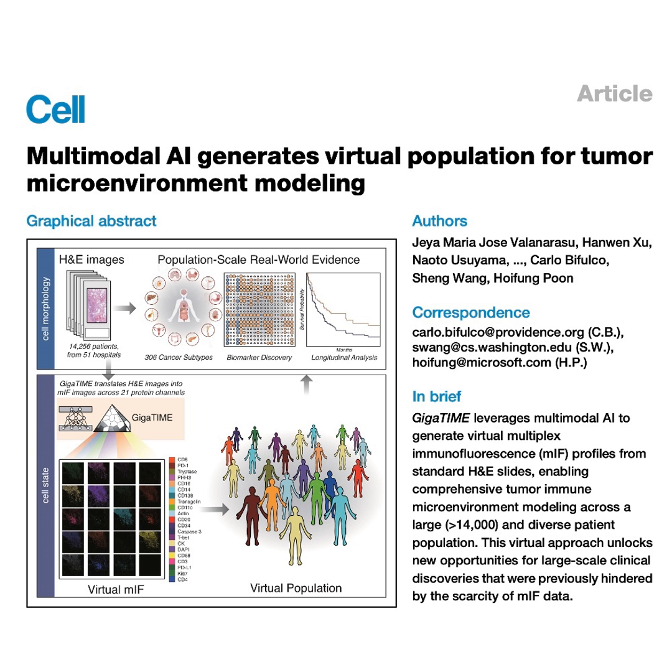First is the pixel level. For this, they use something called the DICE score. It's really asking, did the AI get the exact shape of the protein activation right? It's a segmentation test. So matching the outlines perfectly. As close as possible. Then you move up to the cell level, which uses Pearson correlation.